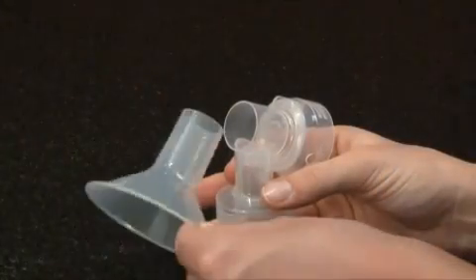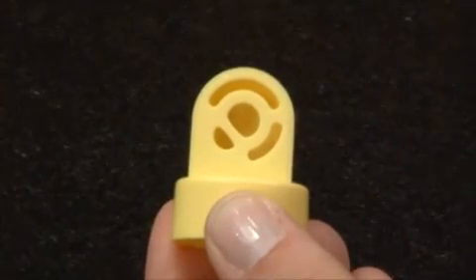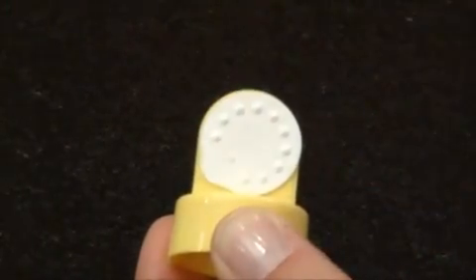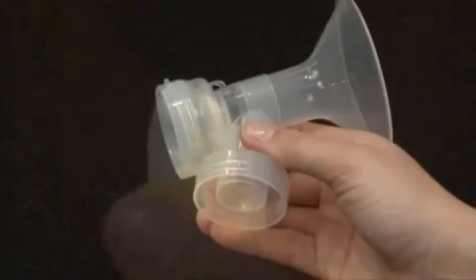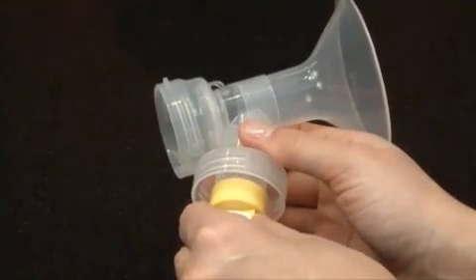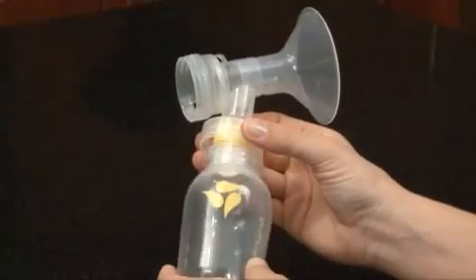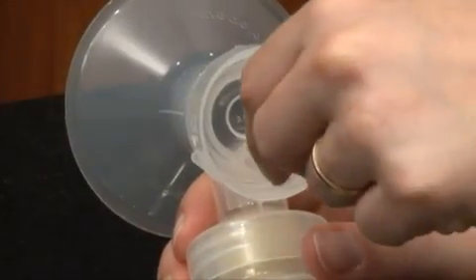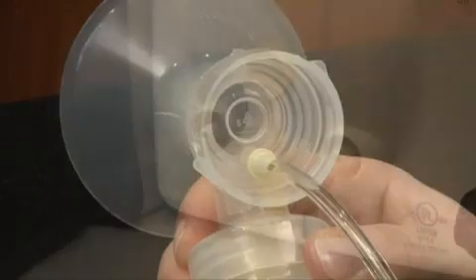Begin assembly by securely attaching the breast shield to the connector. Then, attach the white membranes onto the yellow valves. The white membrane must lay flat against the yellow valve. Push the assembled yellow valves and white membranes onto the breast shield connectors and screw the bottles onto the breast shield connectors. Insert the hard yellow adapter ends of the tubing into the openings in the breast shield connectors.